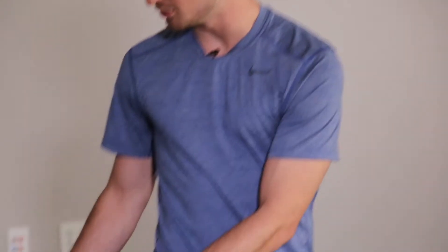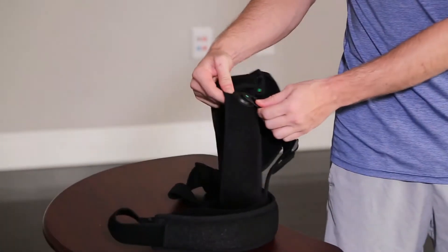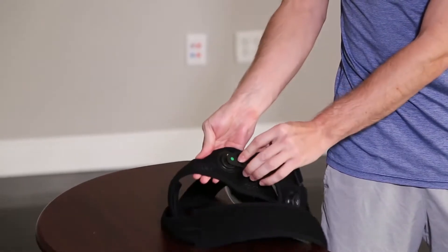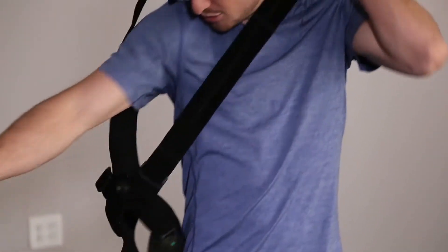Once the shoulder harness has been fitted, connect the clips from the shoulder harness to the thigh strap, and throw it over the affected shoulder.